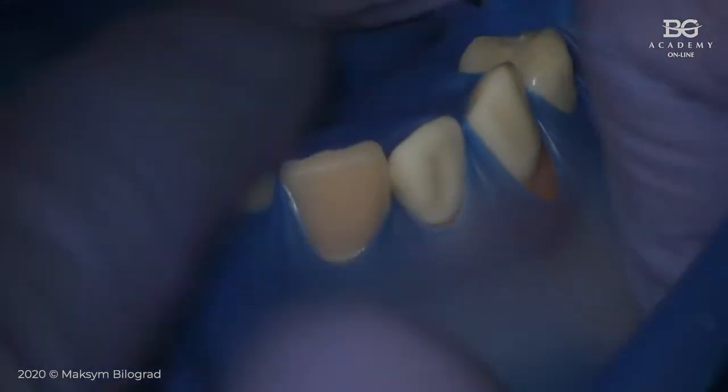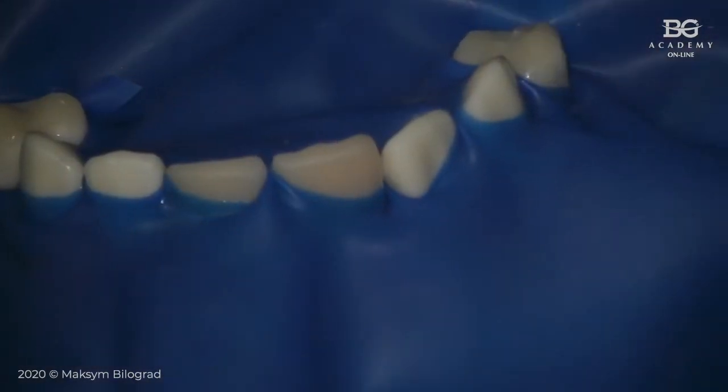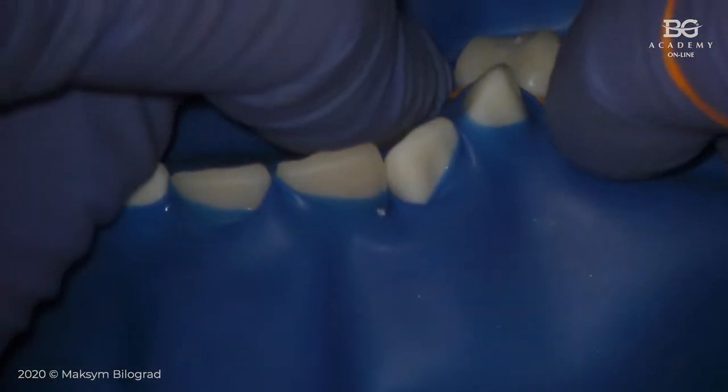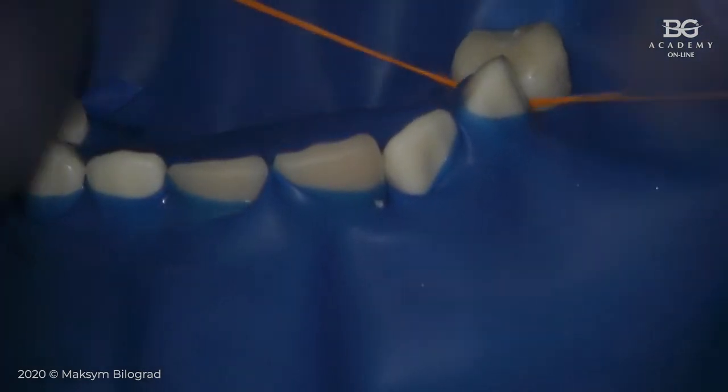And then we will put the frame. Okay, same here, same here. If, for example, the interproximal contact is too tight, before you take your rubber wedge, you have to take some floss. You make an initial inversion here.